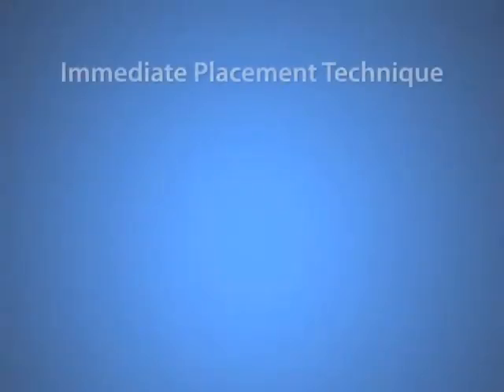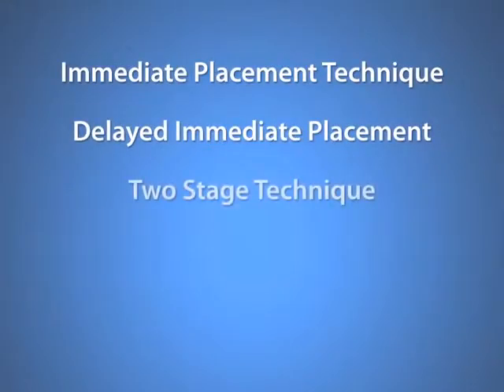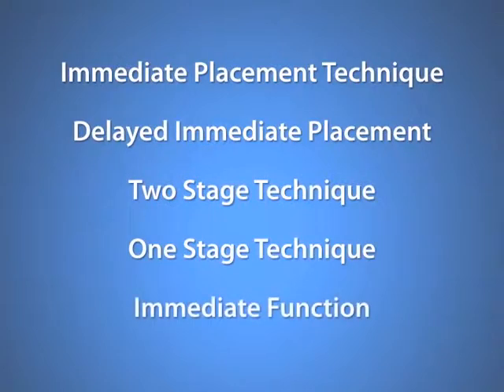The descriptive terminology of the surgical techniques for placing implants refers to how soon after the extraction of a tooth the implant is being placed, and to the manner in which the implant is treated after it has been definitively seated in its osteotomy.